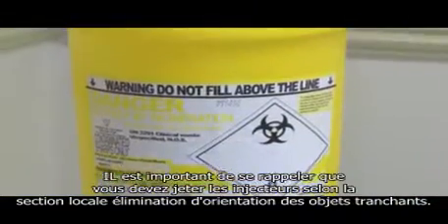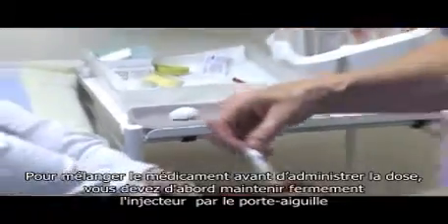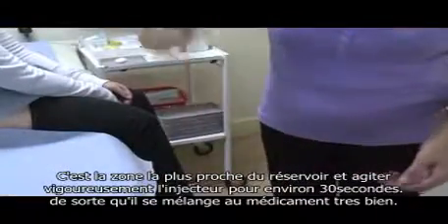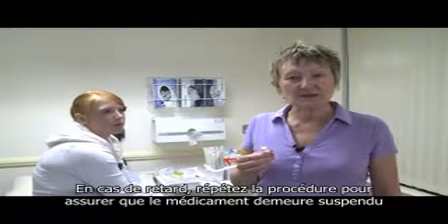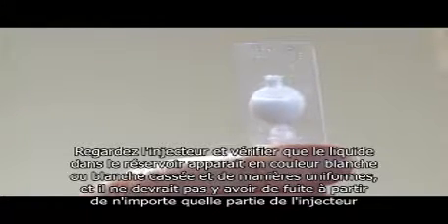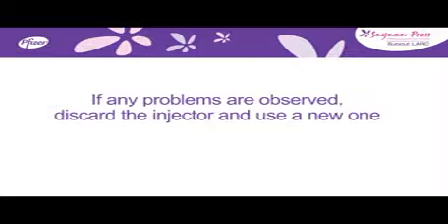It is important to remember that you should discard any injectors according to local guidance for disposal of sharps. To mix the medicine prior to giving the dose, you should first hold the injector firmly by the port — this is the area closest to the reservoir. Then shake the injector vigorously for approximately 30 seconds so that it mixes the medicine thoroughly. Take care not to bend it. If there is any delay between mixing the medicine and proceeding through the next steps, you must repeat the mixing procedure to ensure the medicine remains suspended. Look at the injector and confirm that the liquid contents of the reservoir appear white to off-white and are uniform. There should be no leakage from any part of the injector. If any problems are observed, discard the injector and use a new one.